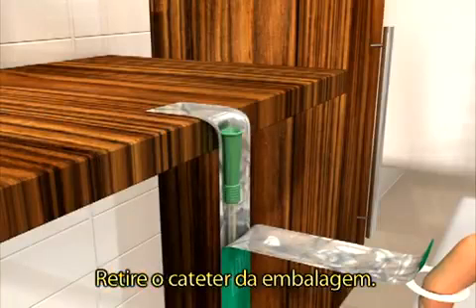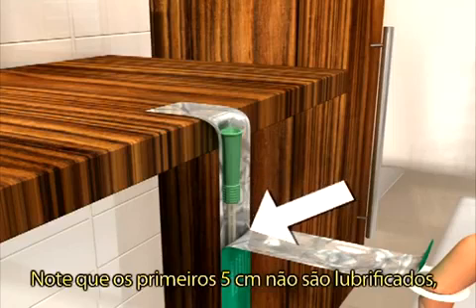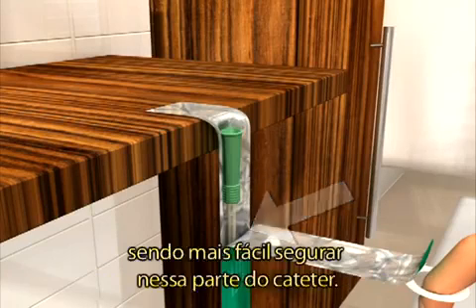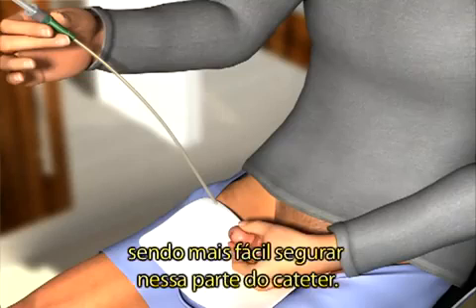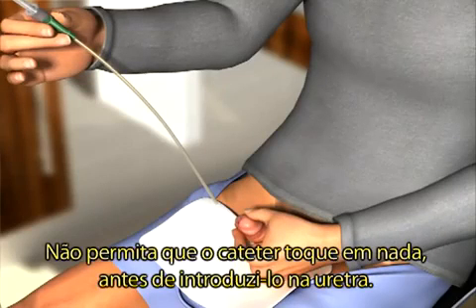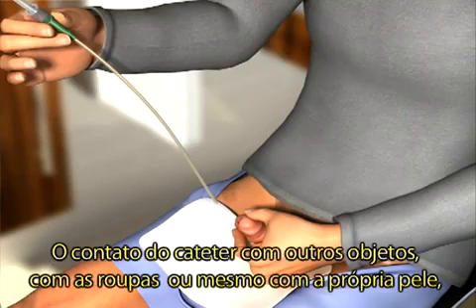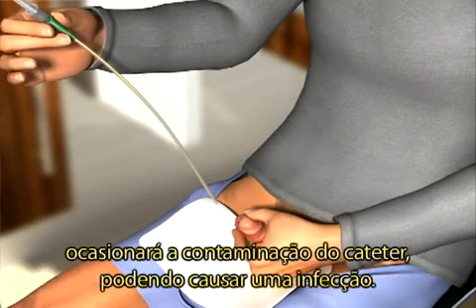Remove the catheter from the pouch. You will notice that the first 5 centimeters is lubricant-free, so it is easier for you to hold. Make sure that the catheter does not touch anything before you enter it into the urethra. If it does so, you must use a new catheter. Touching the sink or your clothes, or skin for example, will contaminate the catheter and can potentially cause infection.